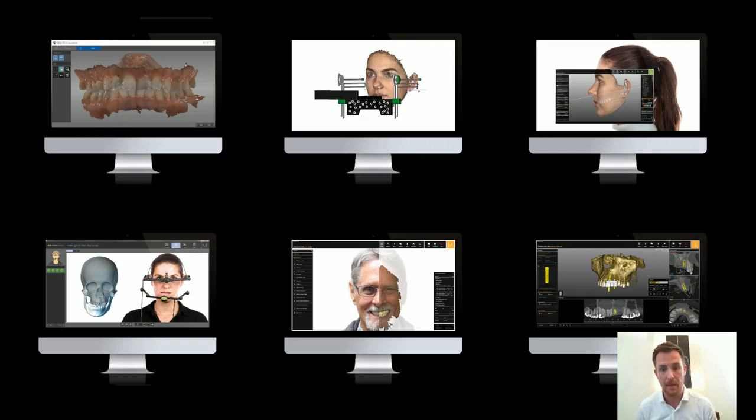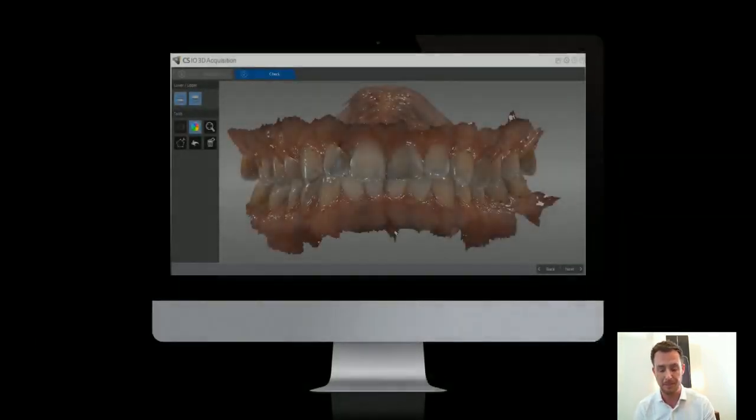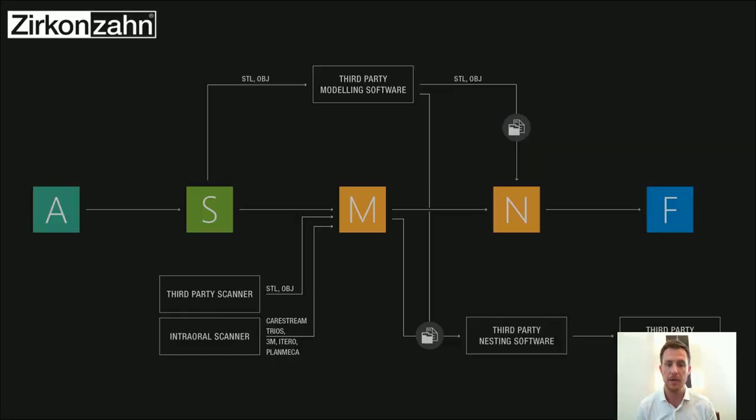Okay, so I prepared those topics: intraoral scan, patient registration, facial scans, then record the mandible motions. Then we go over to the cut part. That means the whole designing process of our patient case, and I will explain a little bit of the implant planner as well. So, as I wanted to tell you, the intraoral scans are a very important part of it.